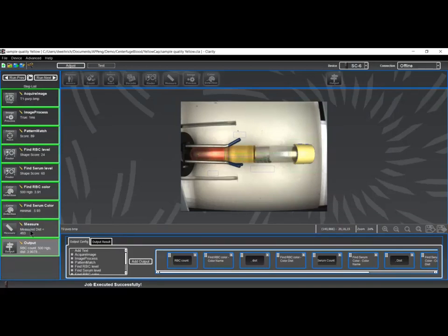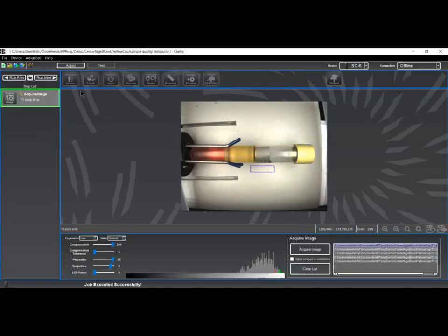We're going to do some measuring, basically a mathematical output of the distance between these two interfaces. And then, of course, we're going to construct the output string that will come out of the machine vision platform that this script will be loaded up into. I've backed all the steps out of my processing for the moment, and we'll build up the processing that's required as we go along here.